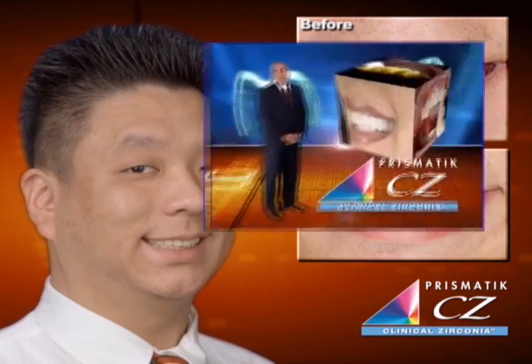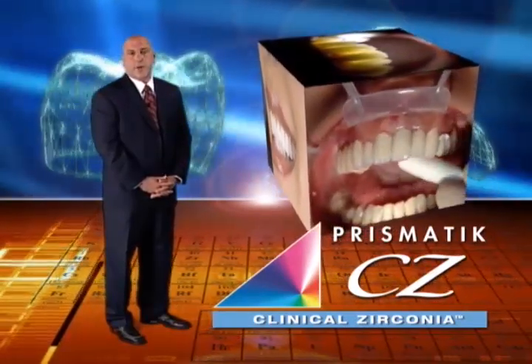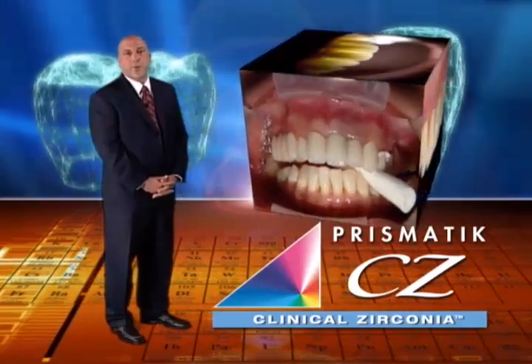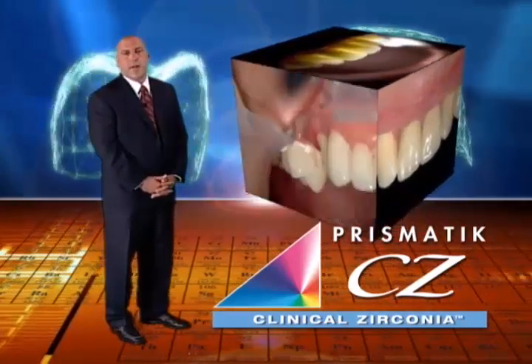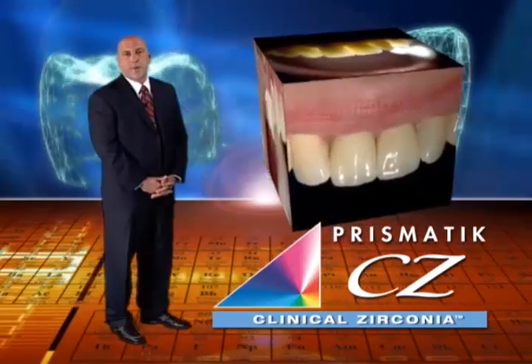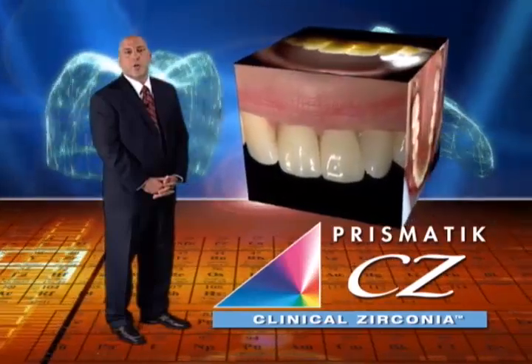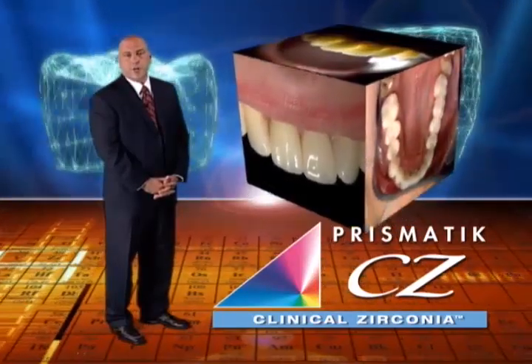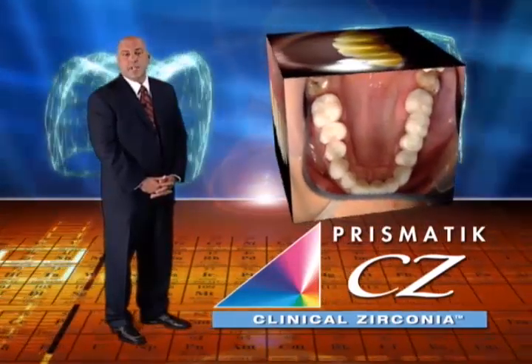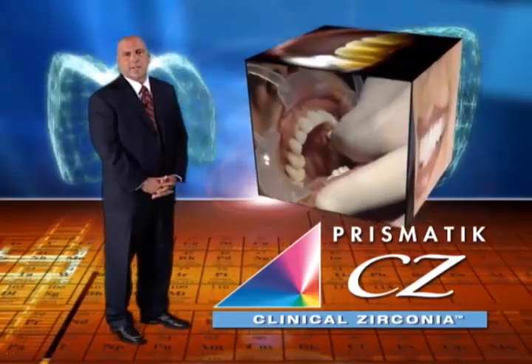The indications for all ceramic restorations have increased greatly since I graduated from dental school 20 years ago. Rather than having to bond every restoration into place, today we have the option of conventionally cementing these new high-strength all-ceramic restorations. With very strong substructures such as zirconium oxide, all-ceramic fracture upon cementation is a thing of the past. And now with our CAD/CAM technology, we can assure predictable and consistent anatomy and aesthetics.